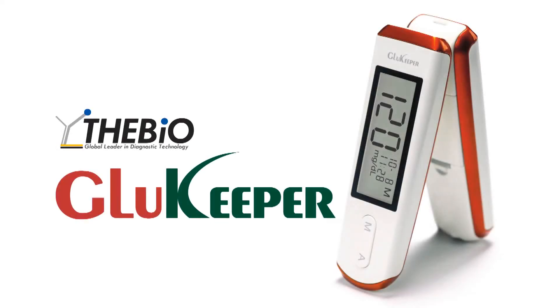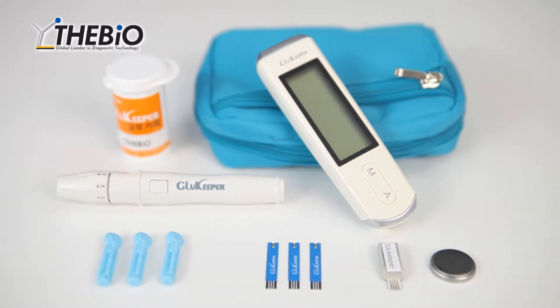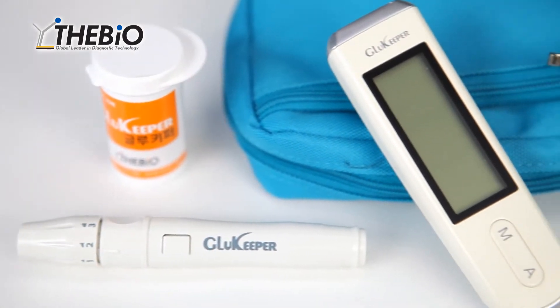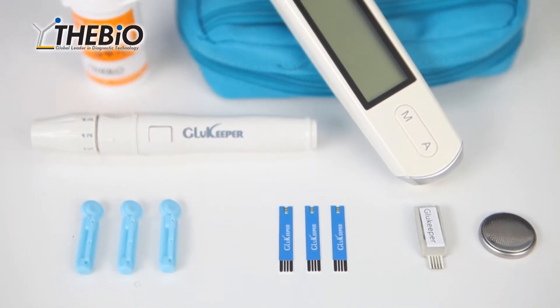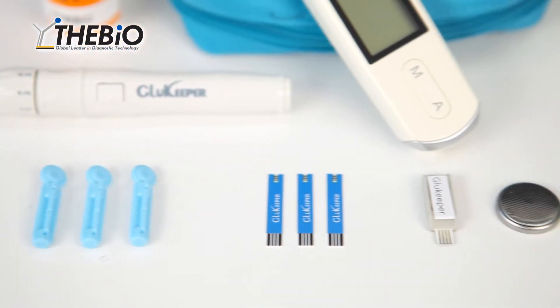The Bio. Glue Keeper. The Bio specializes in research, development, and production of state-of-the-art biosensors. They produce Glue Keeper, the first self-blood glucose checking device. The Bio strives to help increase human health through continuous research and development.